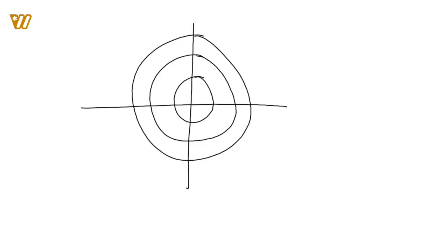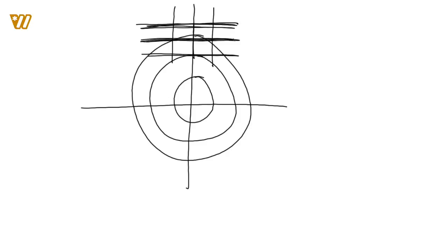So let's look at some of these bullet points. I want to hit on the third one down here. It says, if the center of the crosshairs falls above the center of the bullseye, what kind of prism is going to be induced? Let's draw that picture out. If we have our bullseye here, our tic-tac-toe pattern is going to look something like this. It's above center, so that's going to be base up prism.